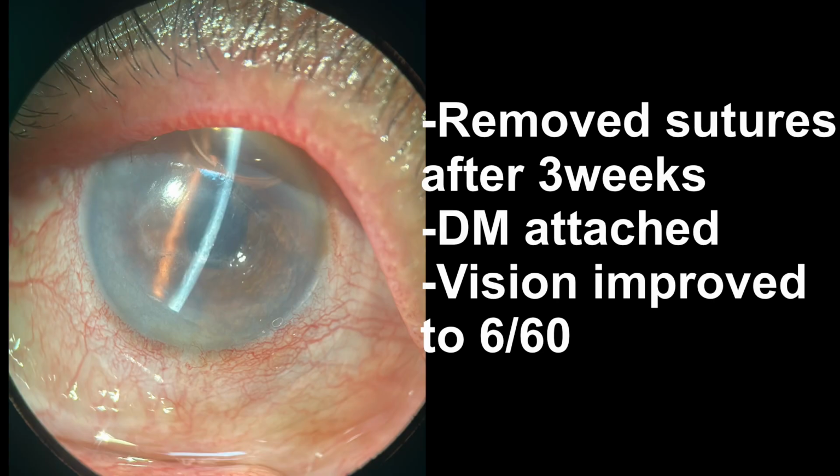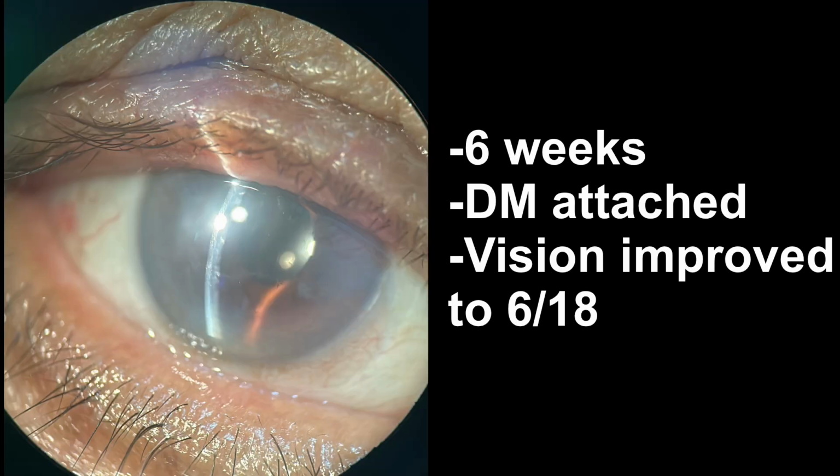After 3 weeks, I removed the sutures. The DM was attached. The vision improved to 6/60. After 6 weeks, the vision improved to 6/18.